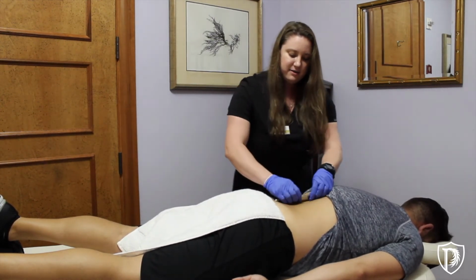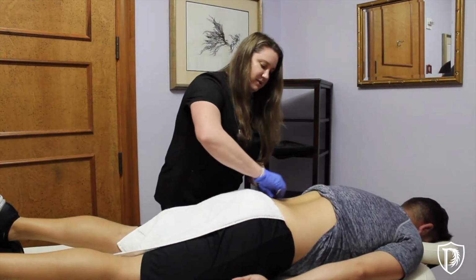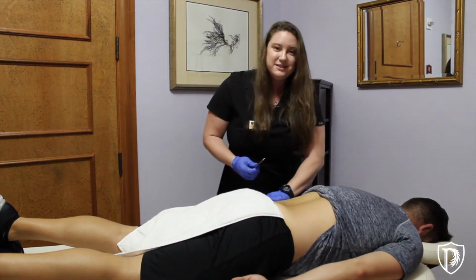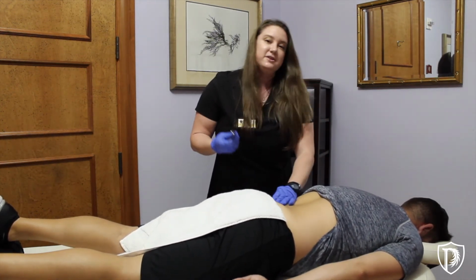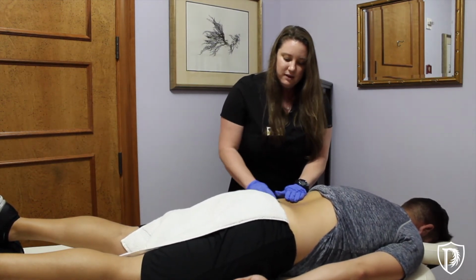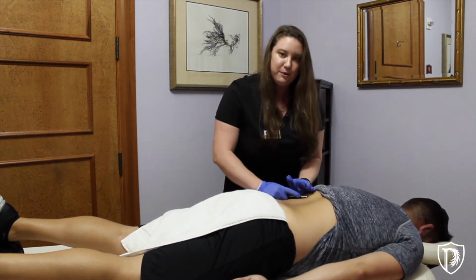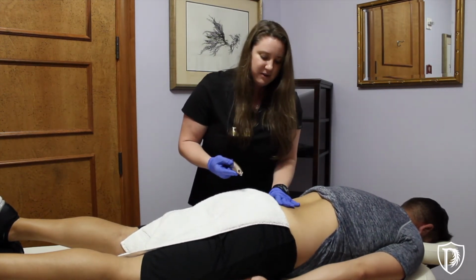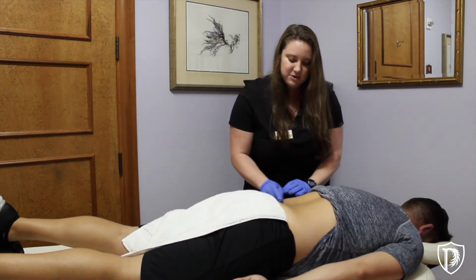So just lightly gliding. I use different strokes to go along with the different fibers of the muscles, go along the pelvis. There's a lot of people with chronic low back pain that get these knots here, like right above the pelvis. That's usually a tender area. You'll see I also combine manual therapy with my hands as well as the tools. And like I mentioned before, stubborn scar tissue gets in areas where you have chronic pain or past injuries, and these tools also actually help me to feel that better than I can feel with my hands. So I can pinpoint the treatment area more specifically with these instruments.